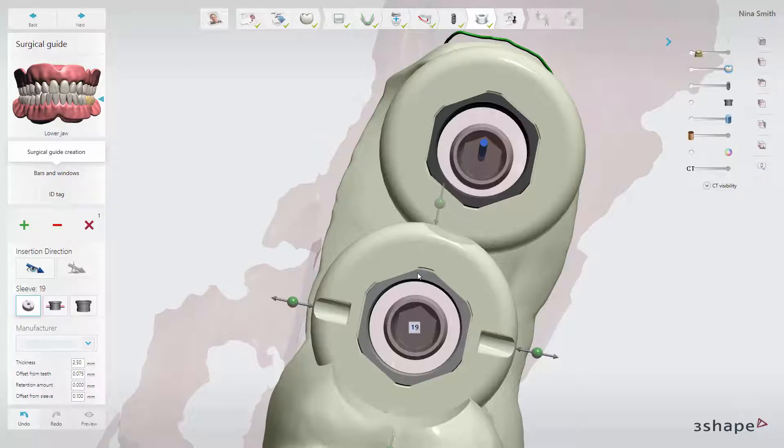Sleeve orientation marks are only useful when you also work with implant drivers with rotation marks. When the mark on the implant driver and the mark on the sleeve are aligned, you will know how the implant is rotated in the bone.